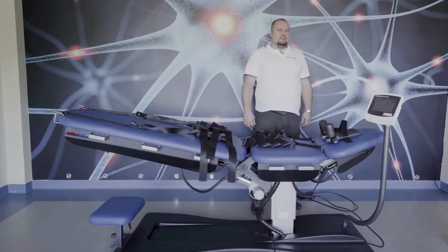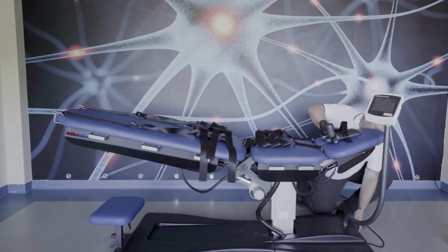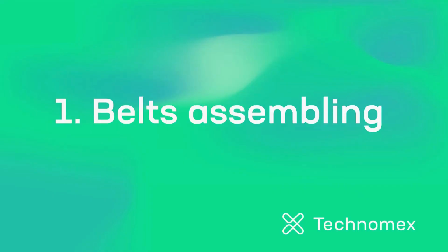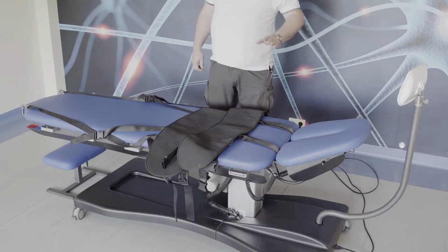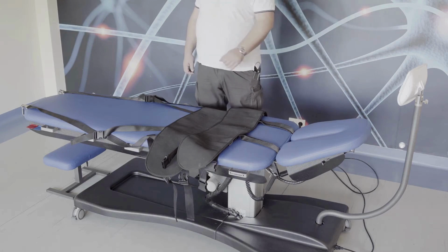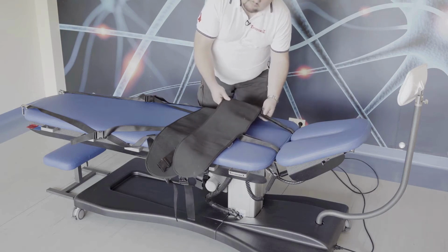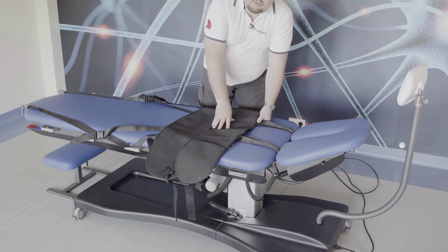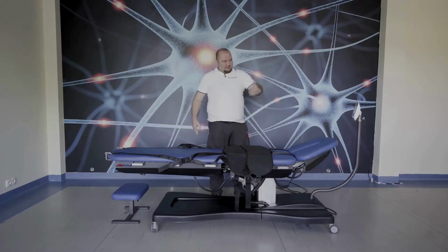To start working on the table, you must plug it in and press the power button. Closing the belts. First of all, before setting the patient in the belts, you must remember to leave the strips a little more free, a little longer than they should be, because it's easier to adjust them later.